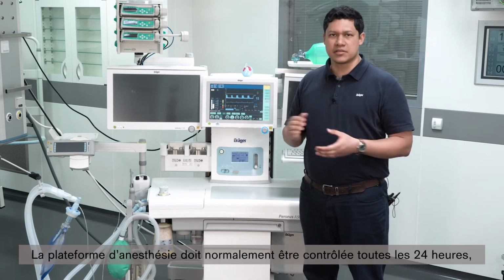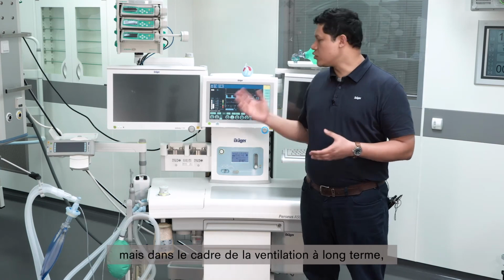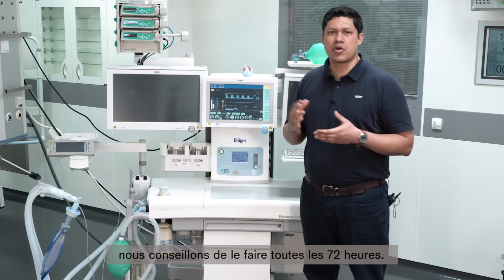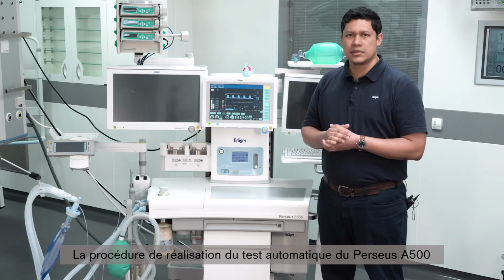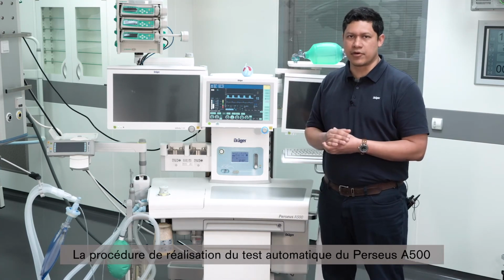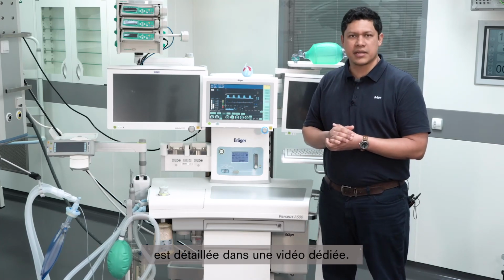The anesthesia device should always be verified every 24 hours. But when used for long-term ventilation, our recommendation is doing it always every 72 hours. The detailed procedure on how to perform the self-test on the Perseus A500 will be provided in a separate video.